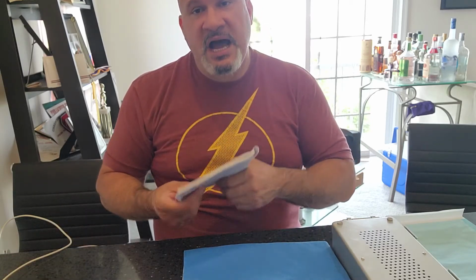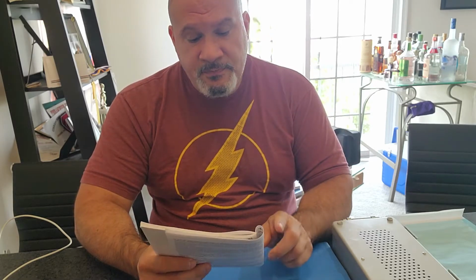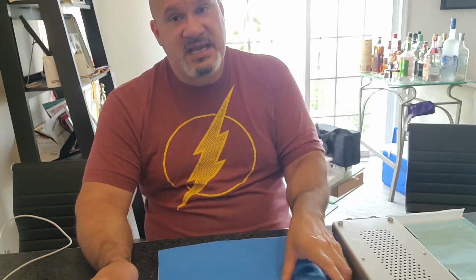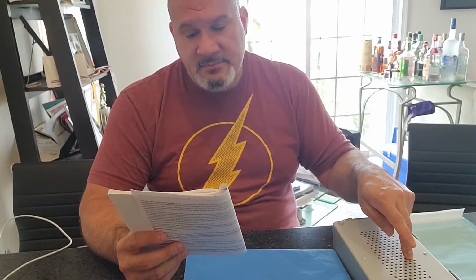Again, read the IFU of the medical device. It may read something like this. After cleaning the device, wrap the device in a suitable material intended for autoclave use. That wrap word can be very confusing because, again, I said this is the only thing we wrap. This IFU went specific into stating, example, pack, sterilization wrap, or bag or accessories.